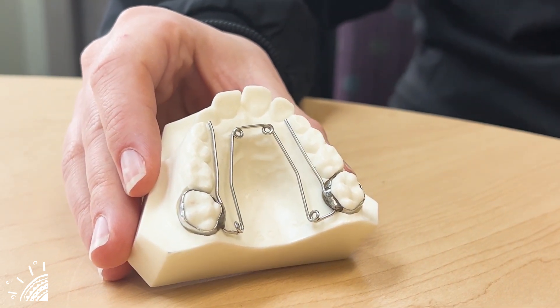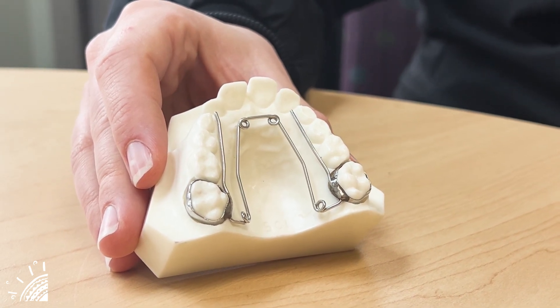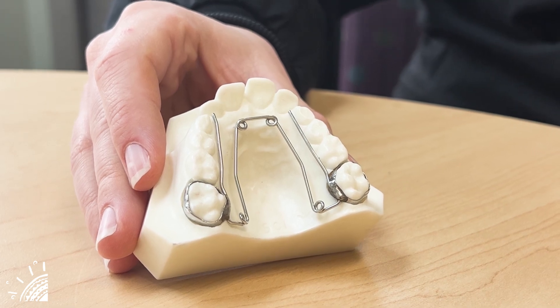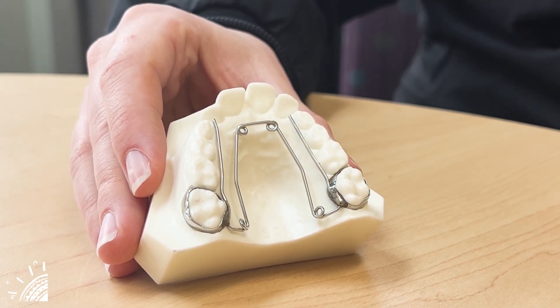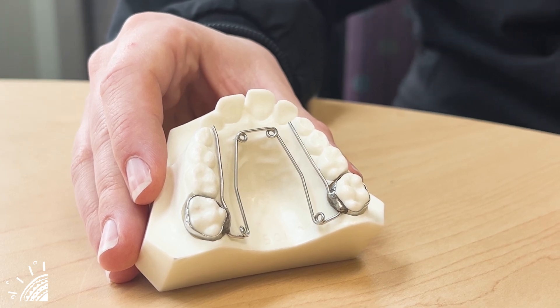This appliance is self-activated — you don't need to turn a key or anything like that. Sometimes the orthodontist may need to make small adjustments to it, but for the most part it's self-activated and it will get that wideness that we need.